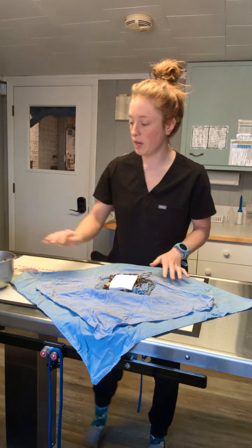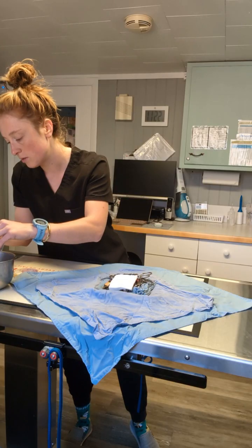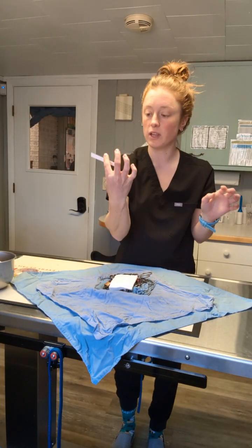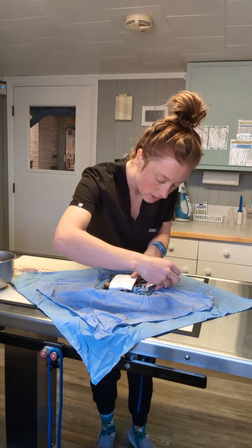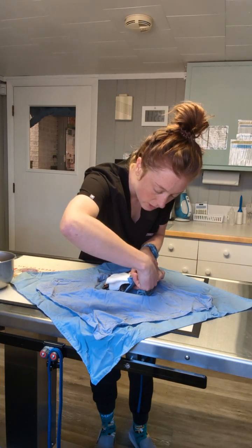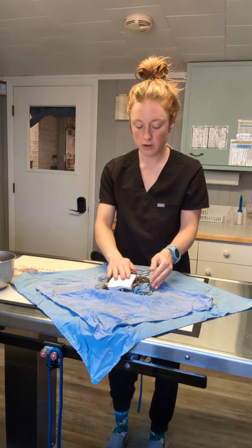Once everything is arranged, I'm going to add a sterilization indicator. So it starts out looking like this. It's kind of a light yellow. And then I want to make sure this is tucked into the very center of the pack, and that color will change to indicate that it has been adequately sterilized all through the pack. Let's just tuck that in there.